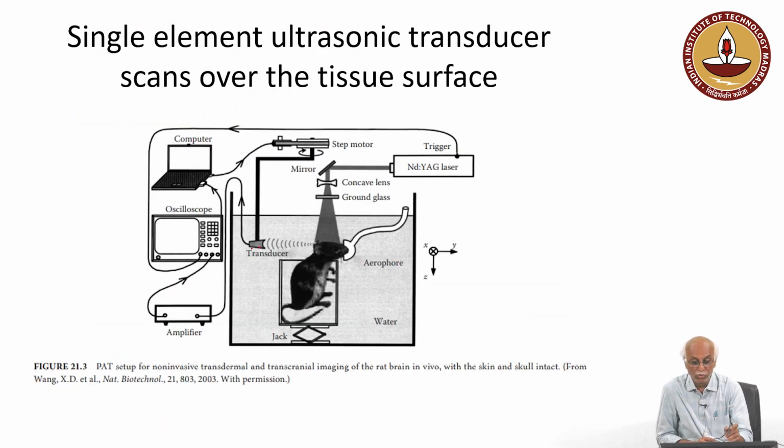So, this technique has evolved first with photoacoustic imaging modalities, and from 2000 onwards such photoacoustic techniques have been developed.